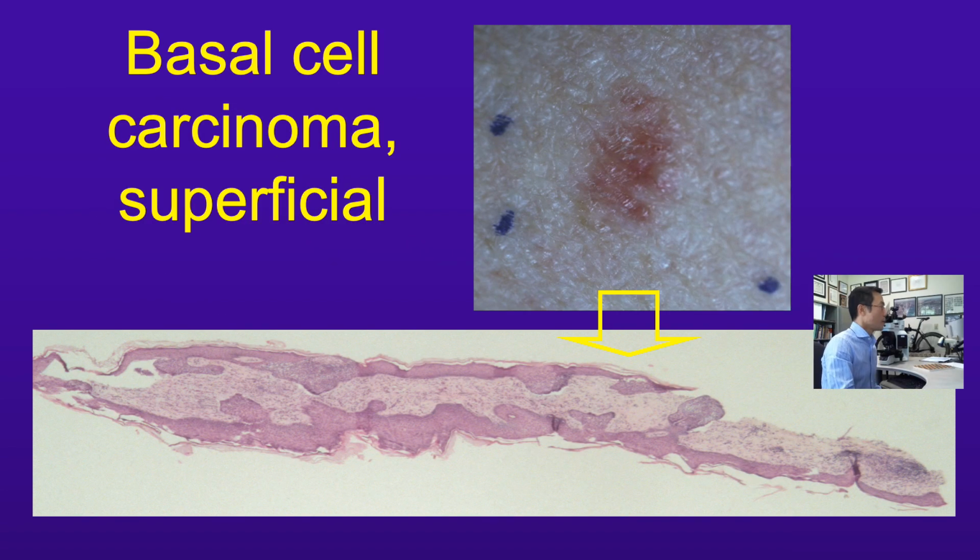The vast majority of basal cell carcinomas can be readily, quickly, and accurately diagnosed, even from scanning magnification alone. In this example of superficial BCC, we can see the purple aggregates in a multifocal pattern that represent the tumor, as shown here. Even from low magnification, we can see that there's a little bit of clefting or separation between one area of the tumor and the adjacent stroma.